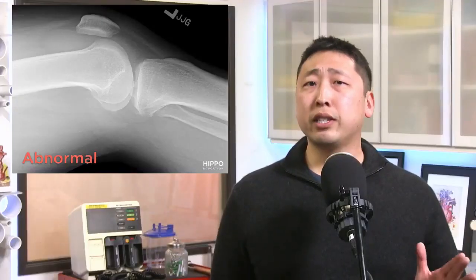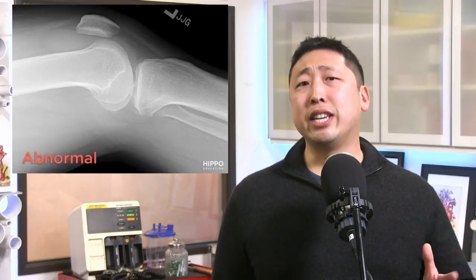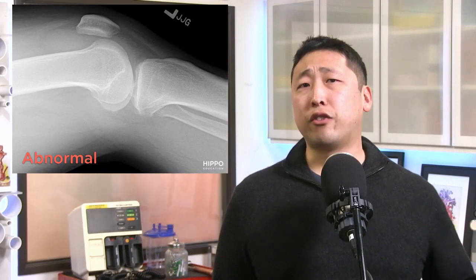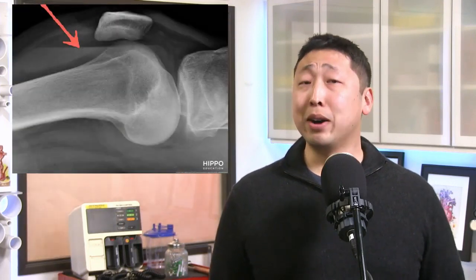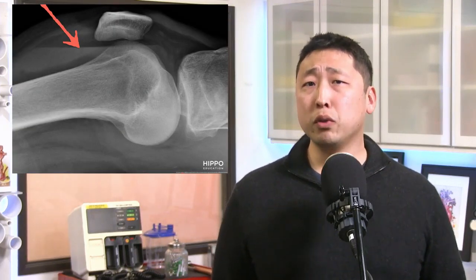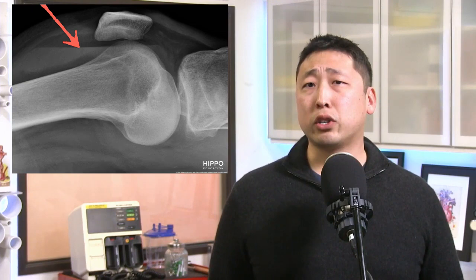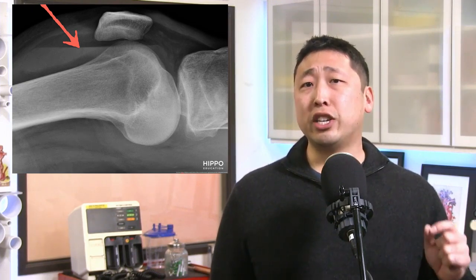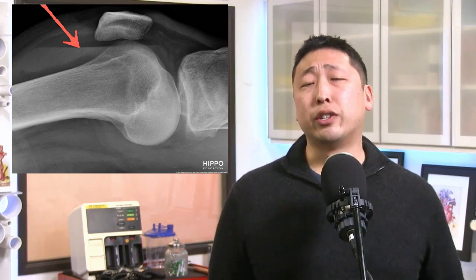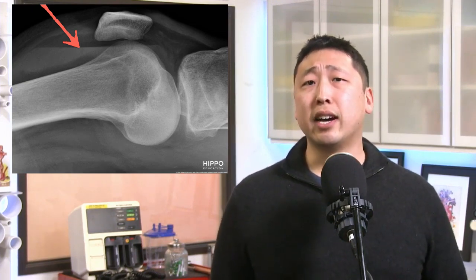The presence of a knee effusion does not mean that there is an intra-articular fracture, but if you see lipohemarthrosis in the suprapatellar pouch with fat and fluid layering out, that highly suggests intra-articular fracture — in this case, a tibial plateau fracture. And that wraps it up for this short. Check out more shorts like this at hippoeducation.com.